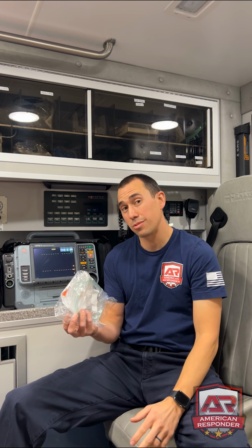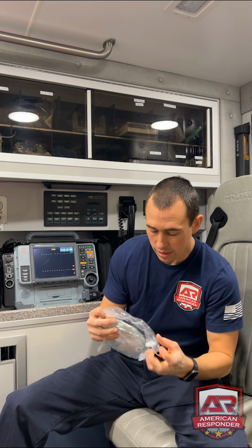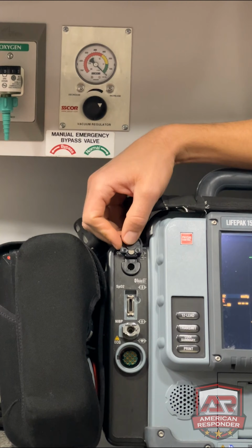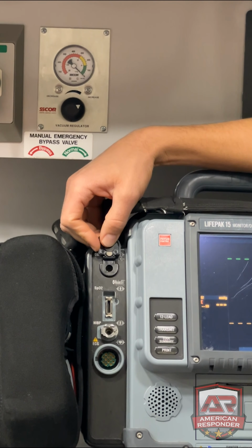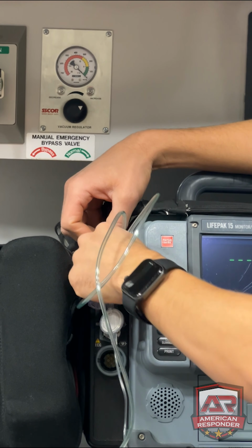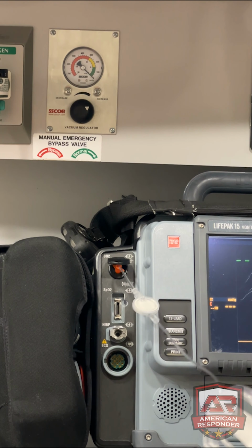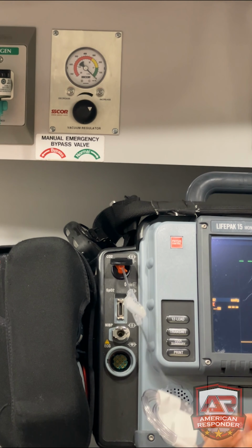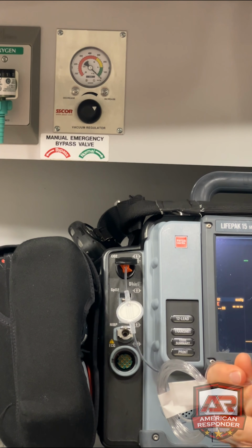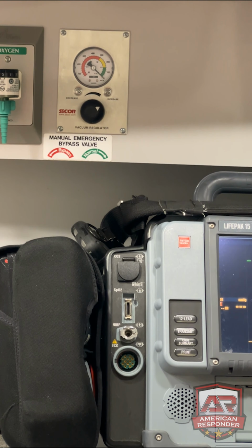So let's look at the waveforms here, and just do mine today and see what it looks like, so I can explain exactly what you're seeing. All you've got to do is take your little orange thing, screw it in here, give it a twist, and do this before you put it on the patient. If you don't do that before you put it on the patient, it will mess up zeroing out. So always make sure you plug it in, then put it onto the patient. Of course, I messed this up a little bit, but it's all right.